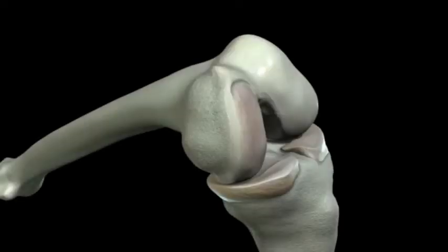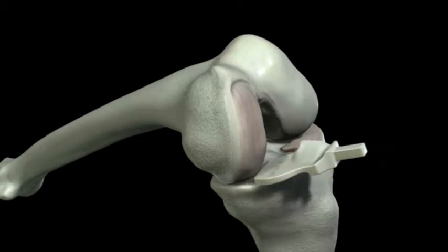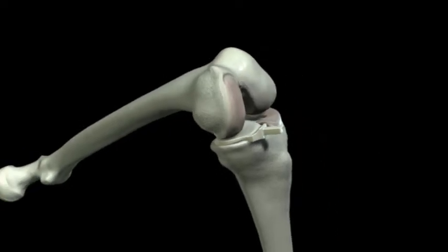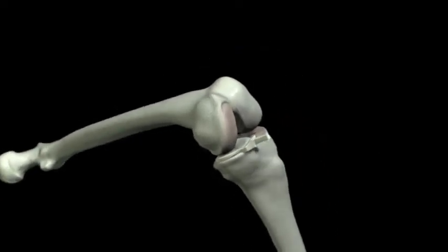Step 2: Balancing the knee. Scrape residual cartilage from the tibial plateau of the affected compartment. Select the balancer chip that achieves the desired ligament tensioning by inserting it between the femur and tibia with the knee in flexion. Bring the knee into extension and confirm desired tensioning throughout the range of motion.